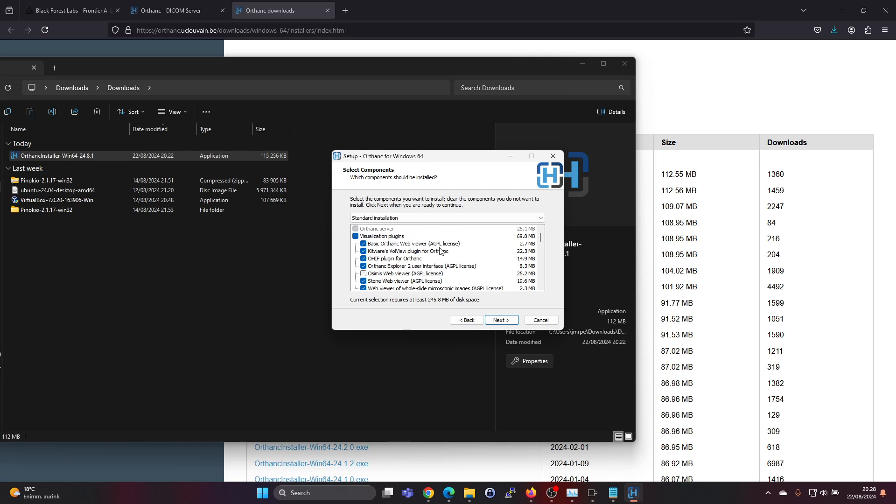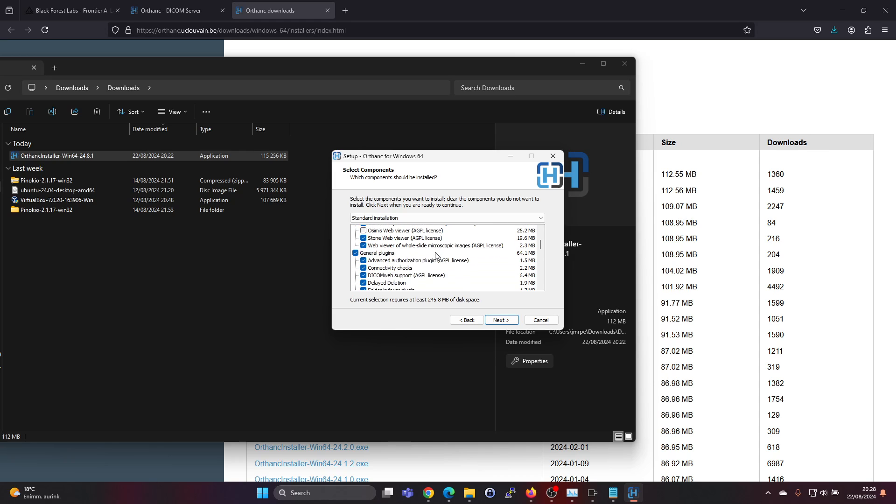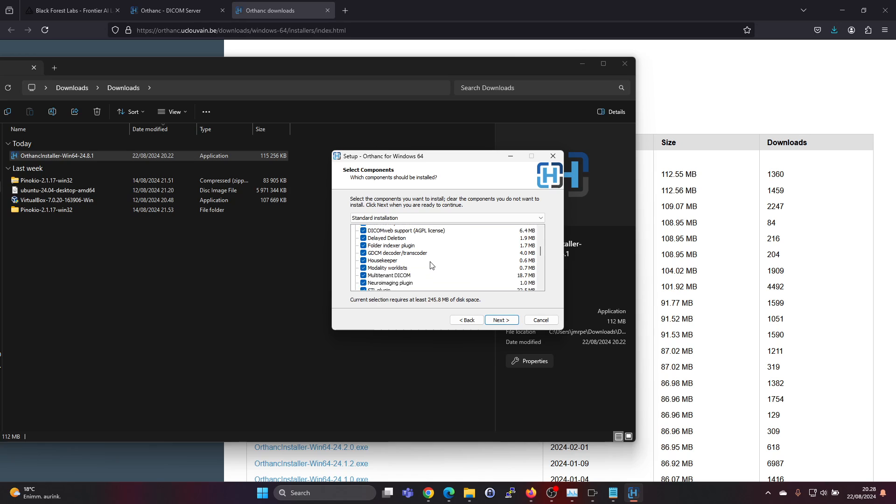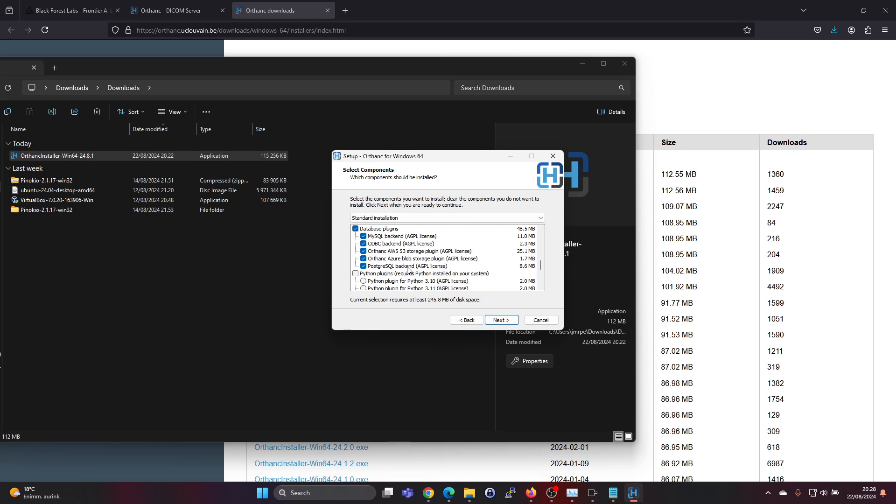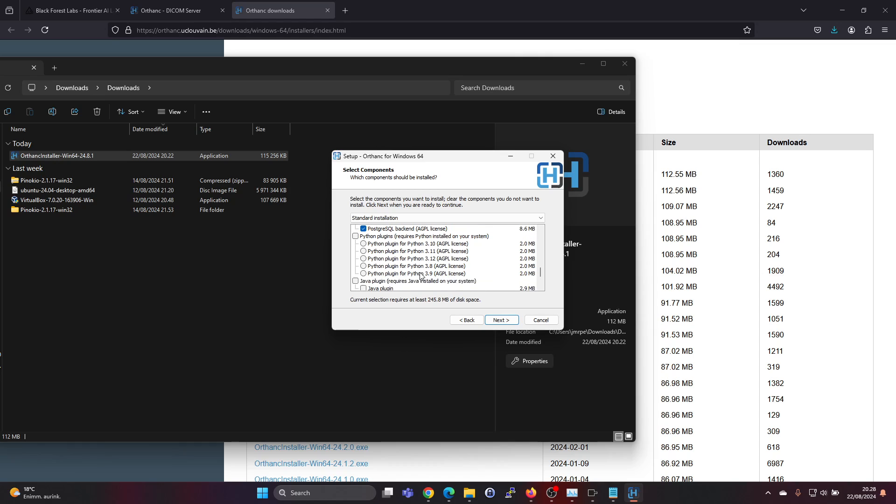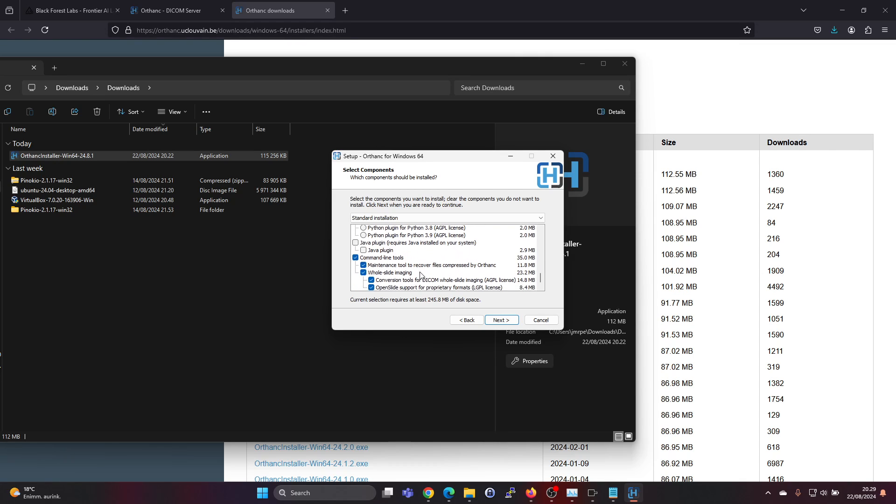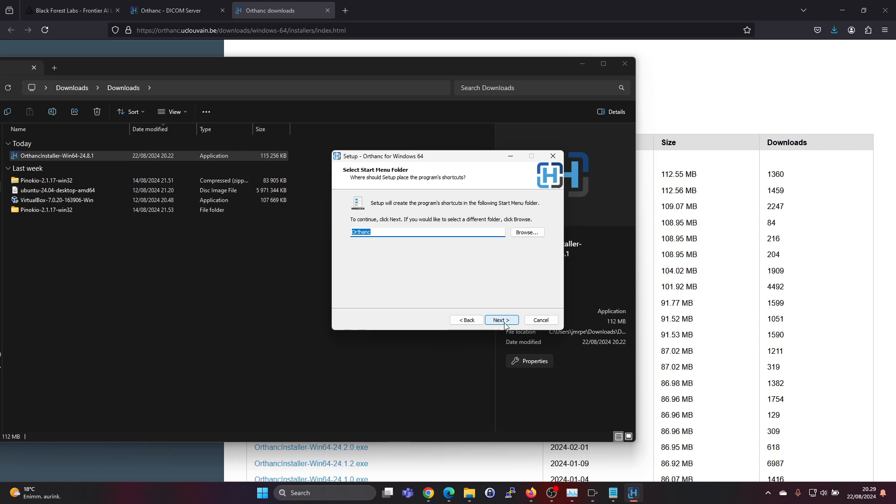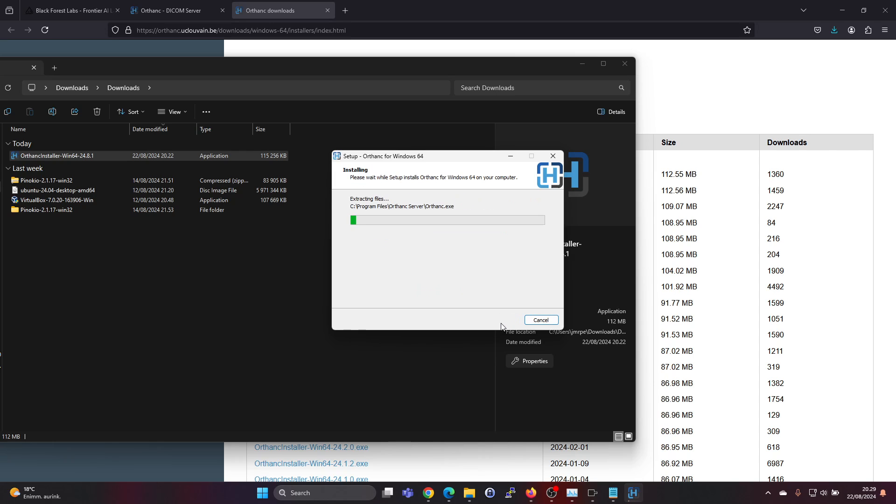Some of them have a different GPL license, so they're not all under the same license, and also the database license as well. Okay, let's click next and install.